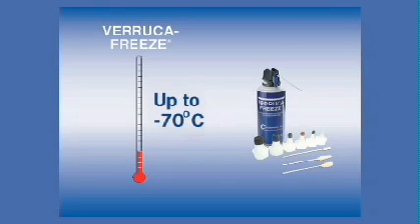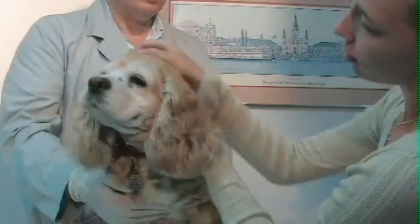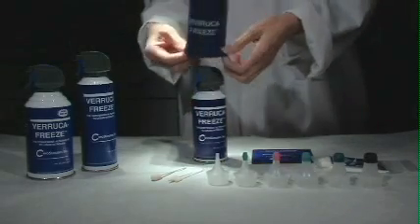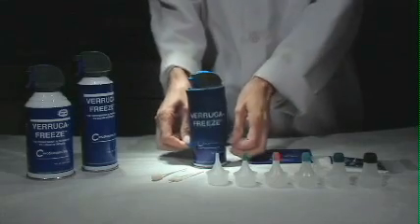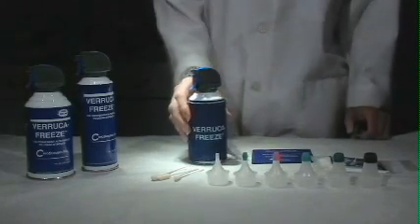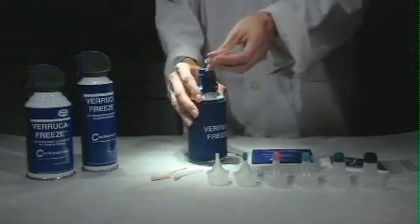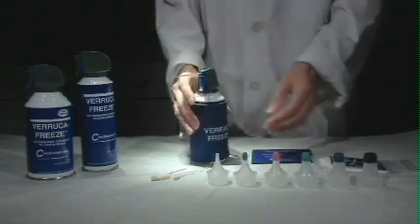For the patient, cryosurgery is a quick 2-minute procedure causing very little discomfort. It is highly recommended that several practice sessions be performed before treating a patient. If the Veruca Freeze insulator is not already in place, carefully slide it over the top of the canister. Remove the safety tab from the top of the nozzle. Place the extender tube firmly into the spray nozzle and test spray the canister by pointing it toward the floor and pulling the trigger mechanism.